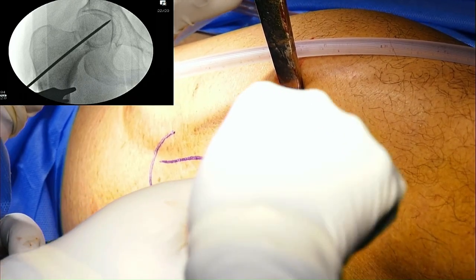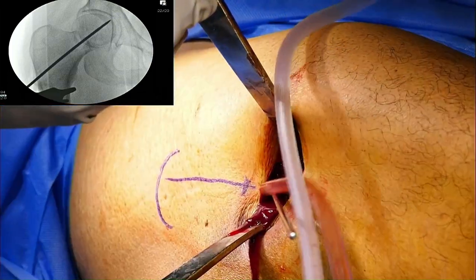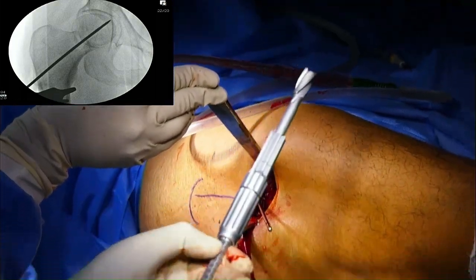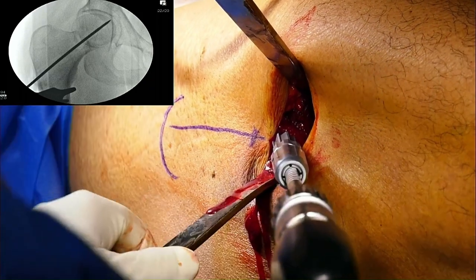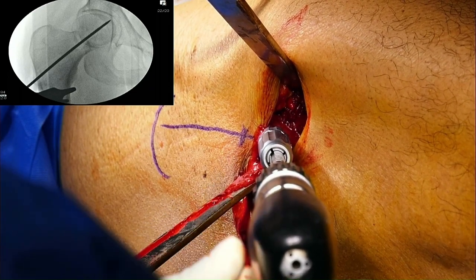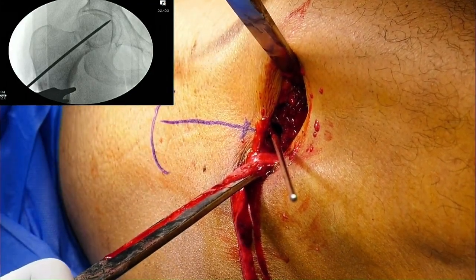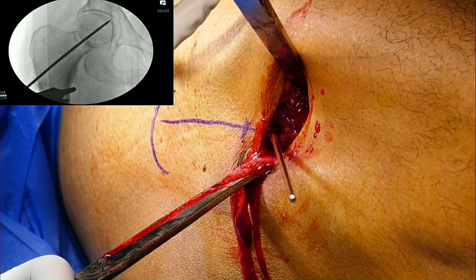We'll keep it at 100 and see. Now, would you like to have a derotation wire at this stage? I cannot hear — derotation wire, would you like it at this stage? Yes, I'll put the derotation before the head. In the heat of the surgery I forgot — I'll put a derotational pin. One more guide wire, please. Thank you, Chailesh, because the head is so small it's going to spin and I'll lose the reduction. Yes, I normally apply K-wires.